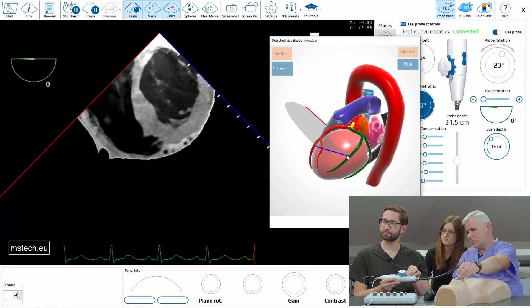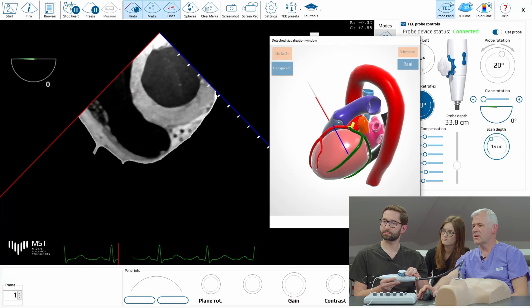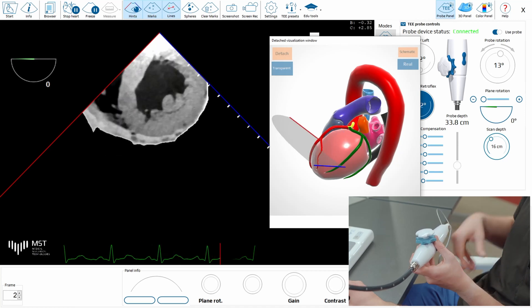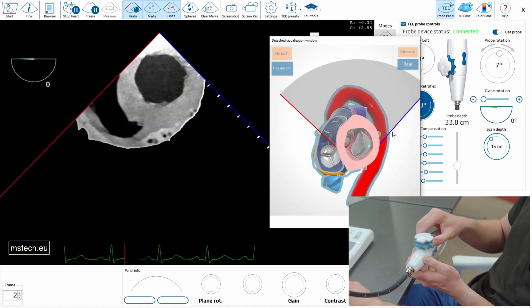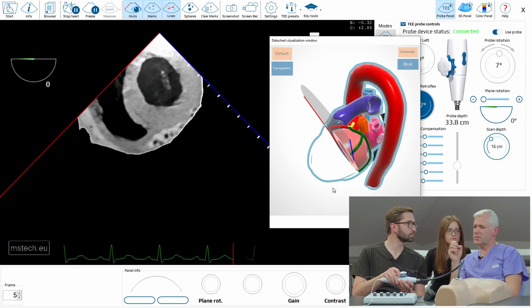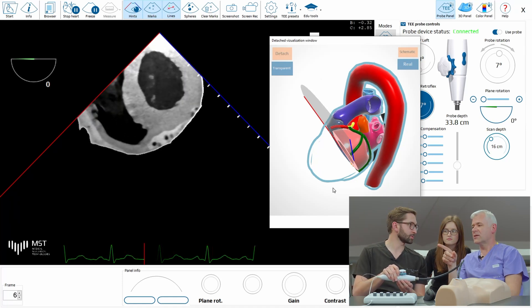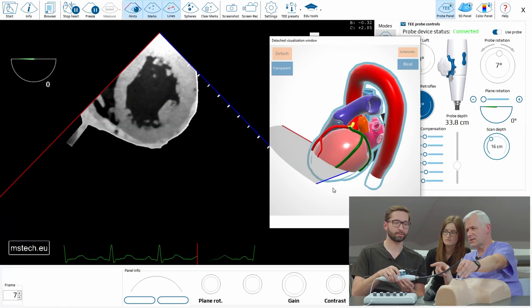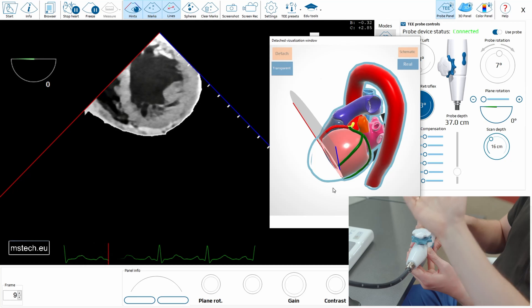You have to use anti-flex to really show the short axis. Then you can go deeper and again anti-flex. You see now the tips of the mitral leaflets. Going deeper with the probe anti-flexed could cause harm to the patient. So release the anti-flex, go slightly deeper — about two centimeters — and anti-flex once again. That way it's safe and at the same time you get the perfect images.